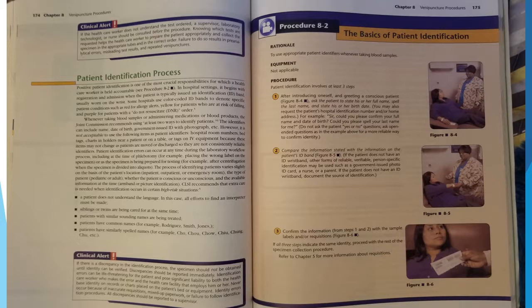Step 2, compare the information stated with the information on the patient's ID band. If the patient does not have an ID wristband, other forms of reliable, verifiable, person-specific identification may be used, such as a government-issued photo ID card, a nurse, or a parent. If the patient does not have an ID wristband, document the source of the identification. Step 3, confirm the information with the sample labels and/or requisition. If all 3 steps indicate the same identity, proceed with the rest of the specimen collection procedure. Refer to Chapter 5 for more information about requisitions.